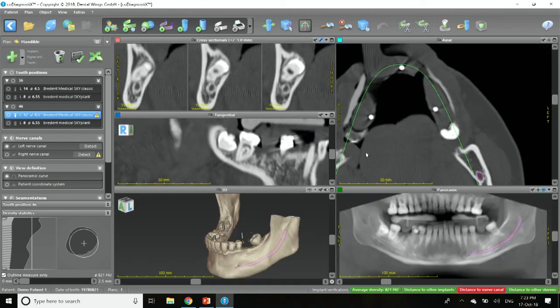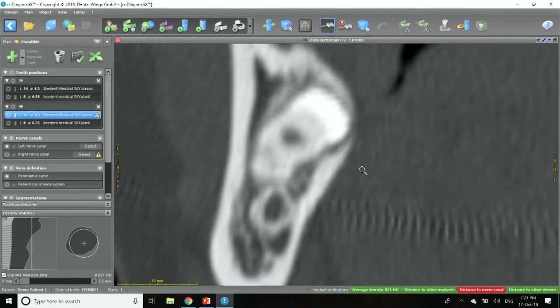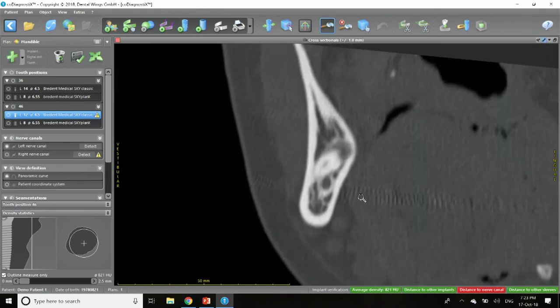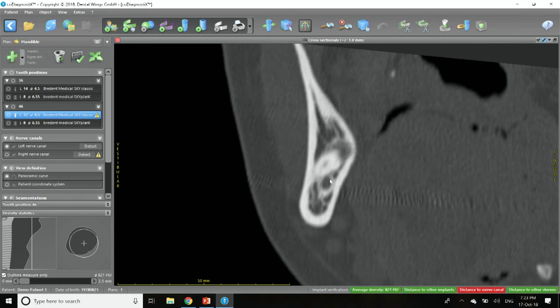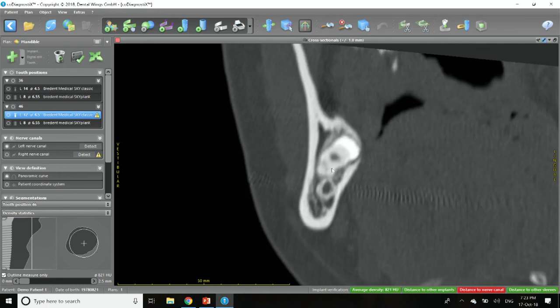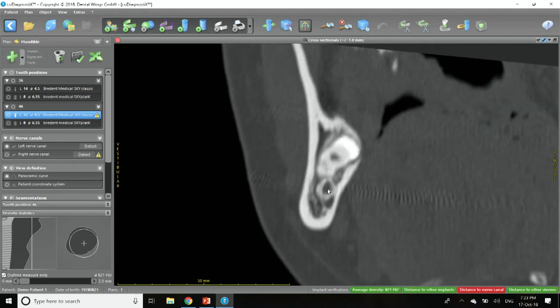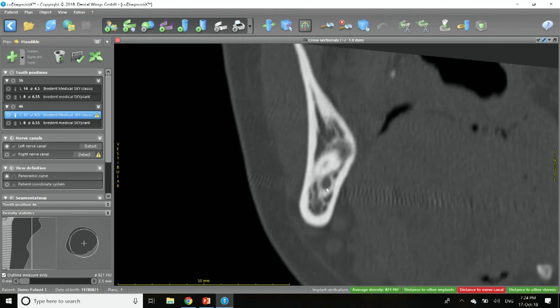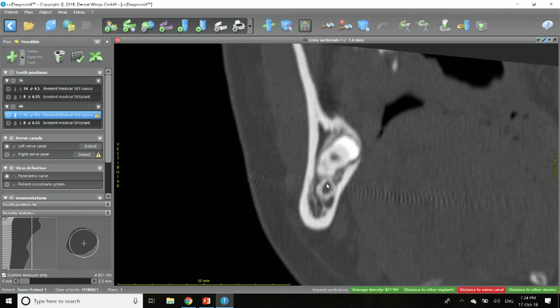Okay, so if we go from the axial view back to the cross-sectional view, okay. Then we start from, for example, the distal. Here we go. Inferior alveolar nerve is here, and you can keep tracing, and there we start seeing the 4-8 with the nerve there. So it is underneath, so it's inferior and goes slightly lingual. Lingual is good. If it's buccal, it's very, very difficult because we access wisdom teeth from the buccal.